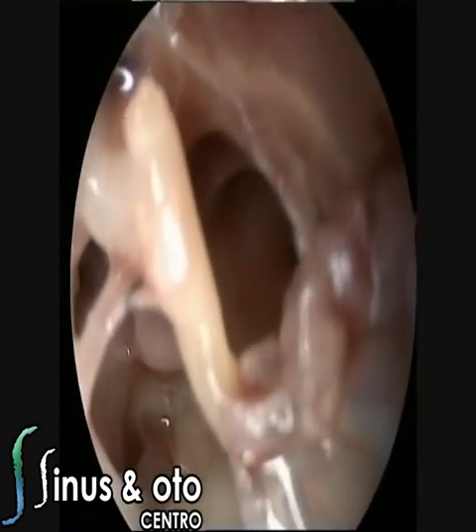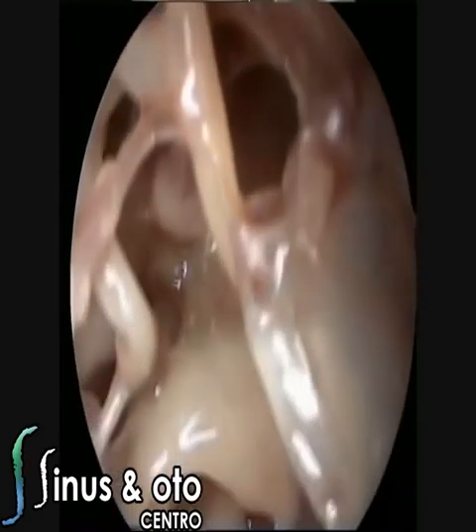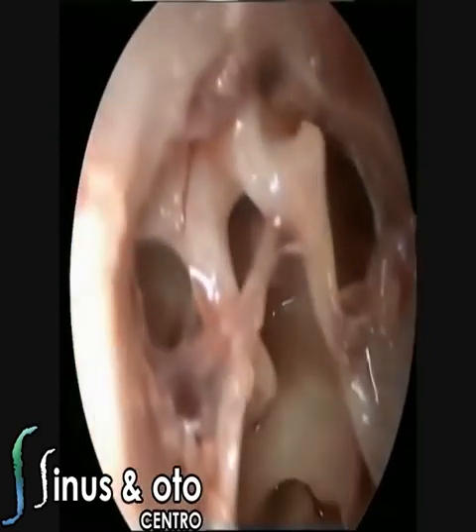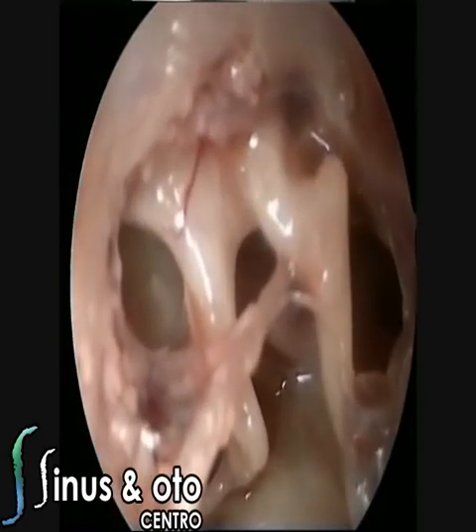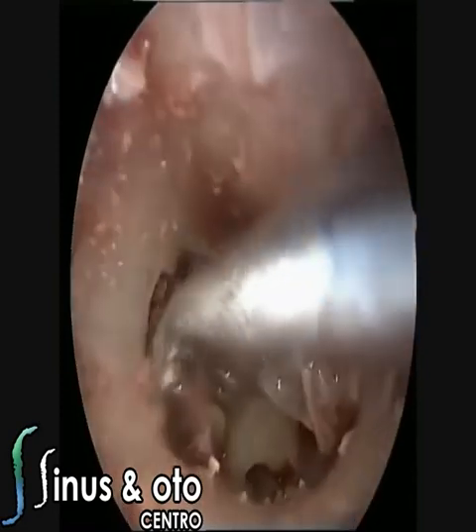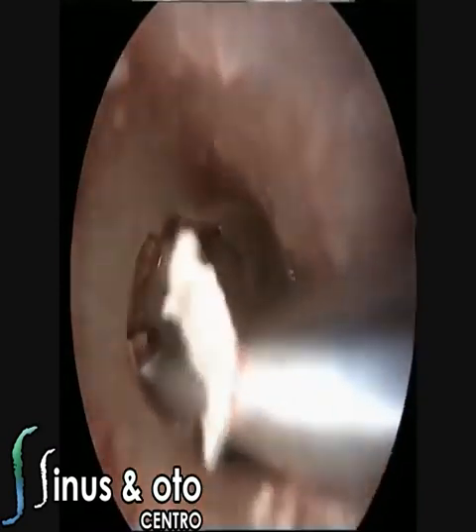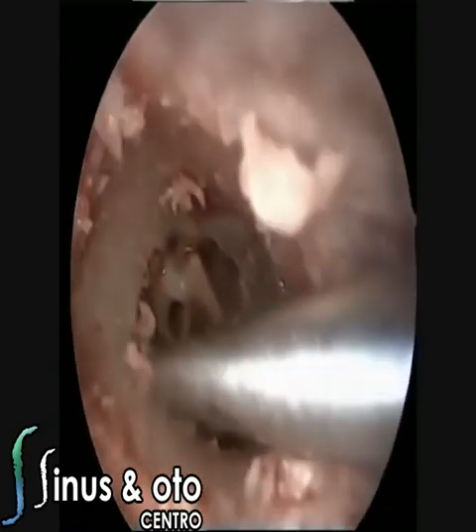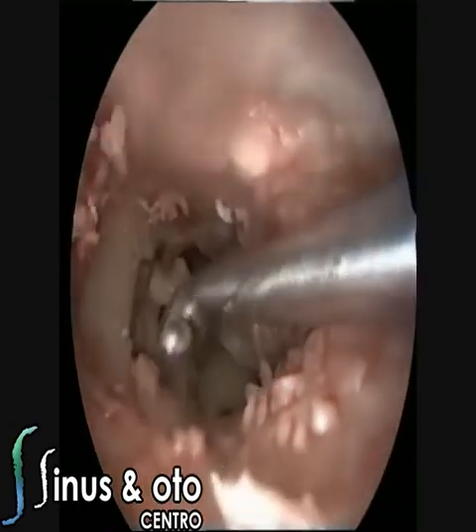This is a 0-degree endoscope, and with the 0-degree endoscope we can see all those structures. The eustachian tube is anterior over there. So you have the stapes, the anterior crus and the posterior crus of the stapes, facial nerve once again, and the lateral semicircular canal. Once you're doing temporal bone microscopic dissection, you think that the lateral semicircular canal is a mastoid structure, but using the endoscope you see that the lateral semicircular canal is actually a middle ear structure. You can find it using the middle ear as a pathway to the lateral semicircular canal.